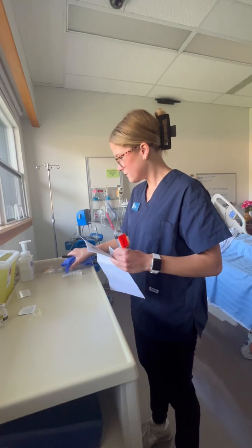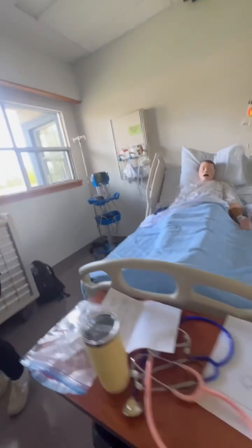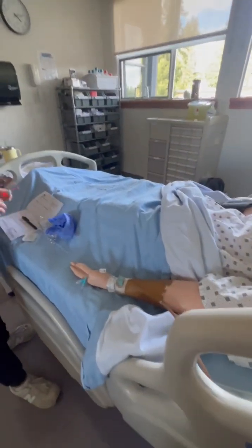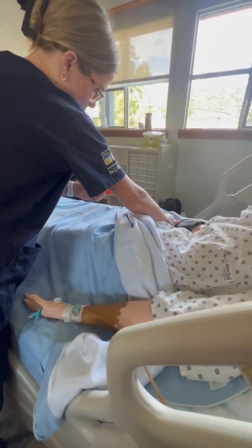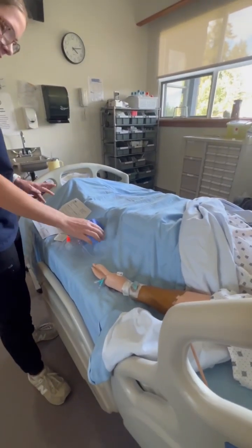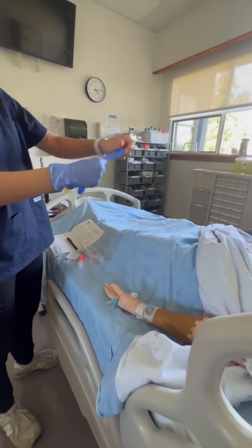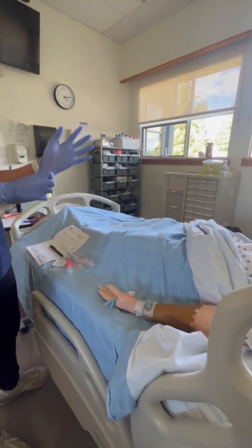I'm going to take all of this over to the bedside. Normally I wouldn't take a needle to the bedside, but just to keep it sterile, I am going to leave it on there. I am making note of that. All right. Hi, Elizabeth. Can you tell me your last name and your date of birth? Perfect. Thank you very much. Ensuring that she doesn't have allergies as well. I'm going to put on my gloves here. I also normally wouldn't take a MAR to the bedside, but for video purposes, just to consult the name and the date of birth, I do have it here.